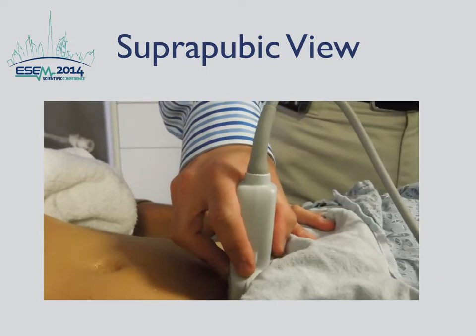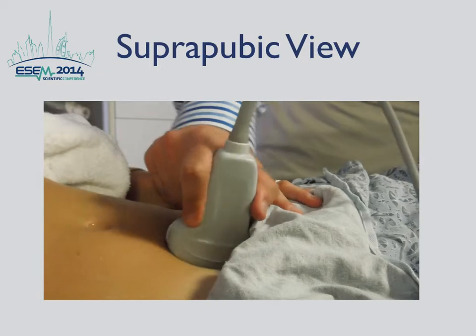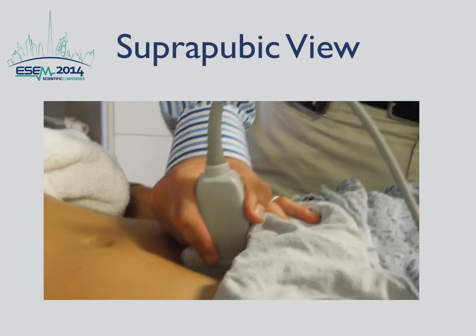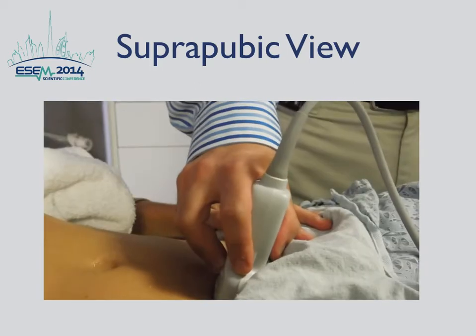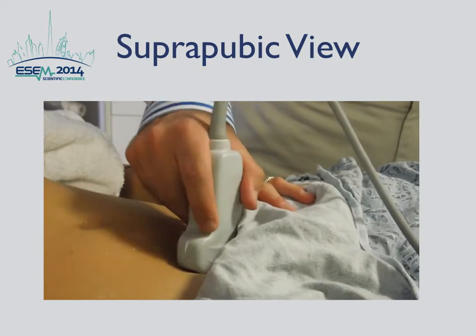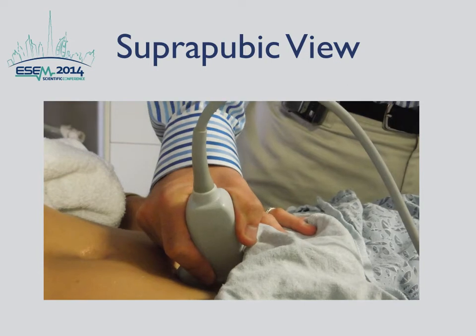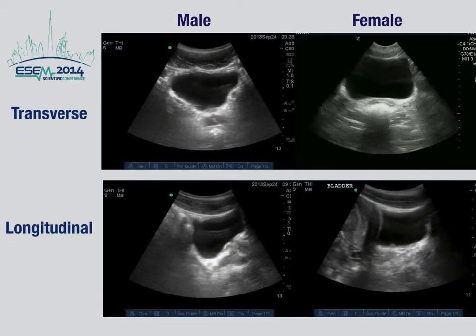Once the bladder is identified, transversely rotate the probe 90 degrees for a longitudinal view. It is important to fan anterior and posterior in the transverse views and slide right to left when you get the longitudinal view in order to fully interrogate this space. These are representative ultrasound images of both views.